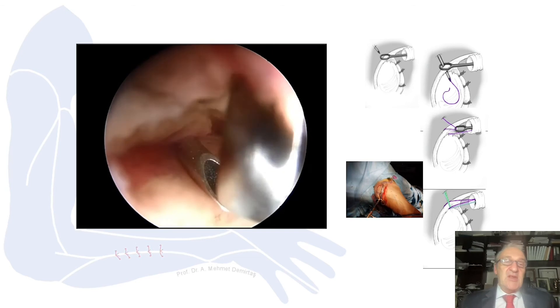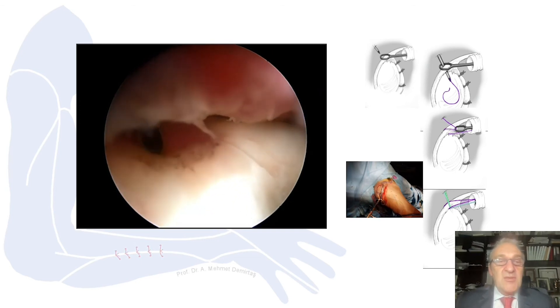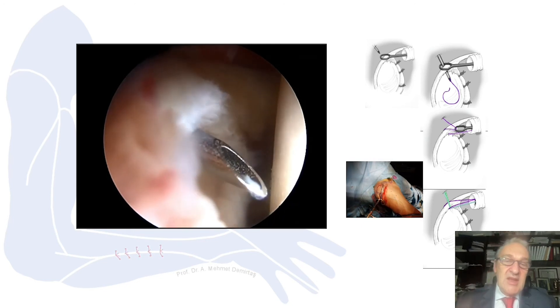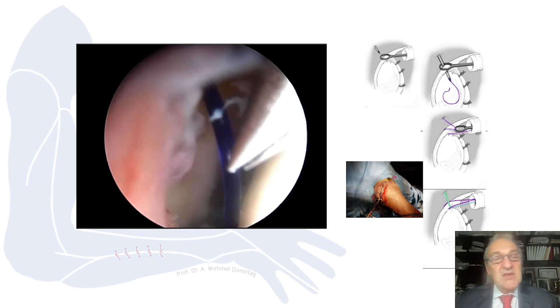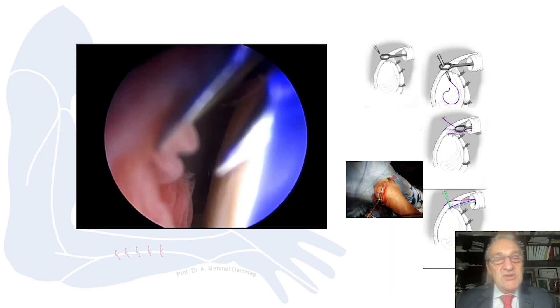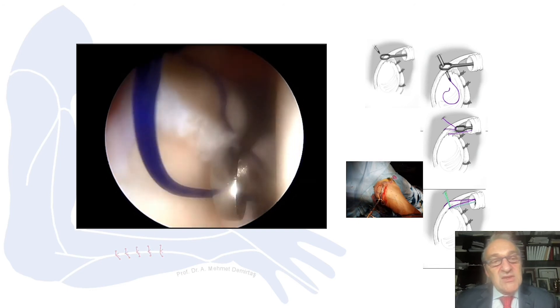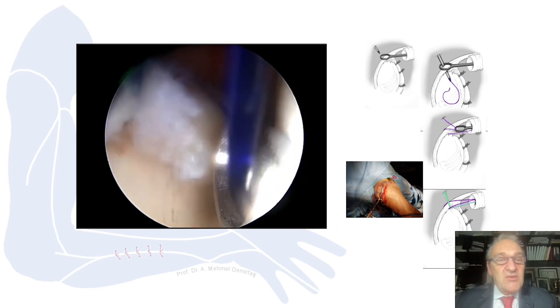I prefer to repair the SLAP last, because I do the most difficult part first — from the deepest 5 o'clock position. For the SLAP lesion, I use epidural needles. You see this is a curette with a hole, because when I put the needle in, it can be very hard to see the other end of the PDS. The epidural needle acts like a suture passer since it has a slightly blunted curved end. With the PDS, I guide it, then use a curette to pull the PDS downwards, and with a bird beak, I catch the suture.